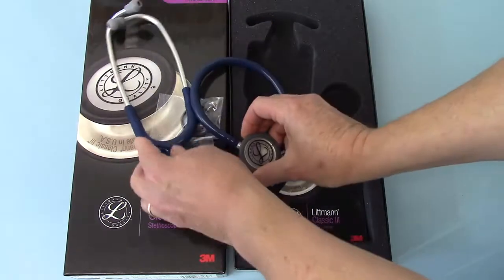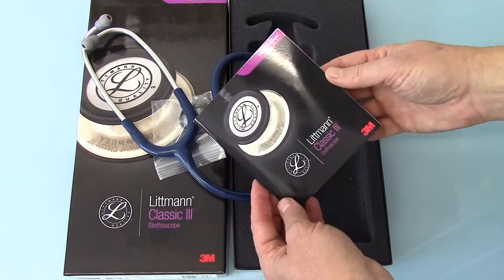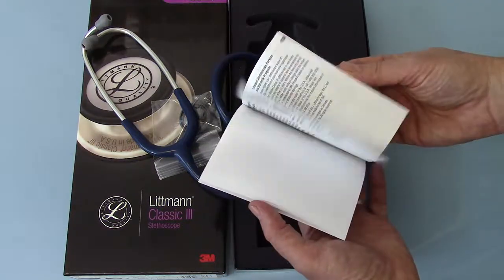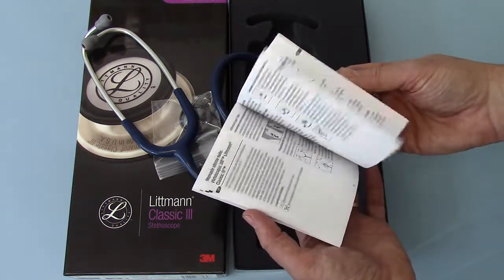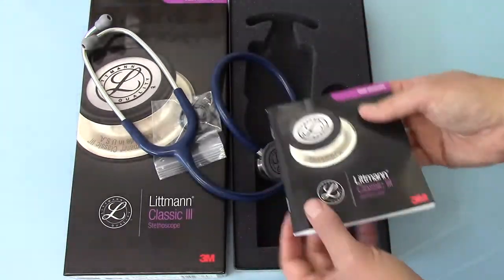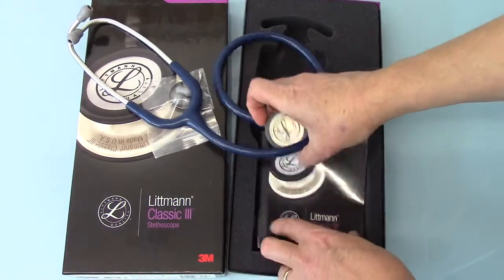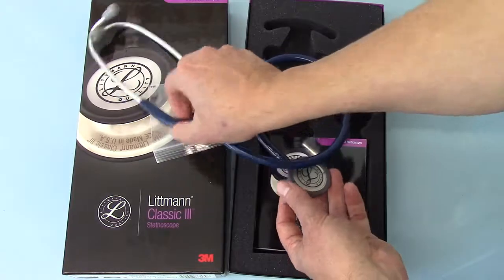Standard stethoscope tubing. The only other thing included in the pack is your Littmann Classic 3 stethoscope user's guide. It gives you basic information in multiple languages — I think there are about 15 or 20 different language inserts — basically giving you care information.